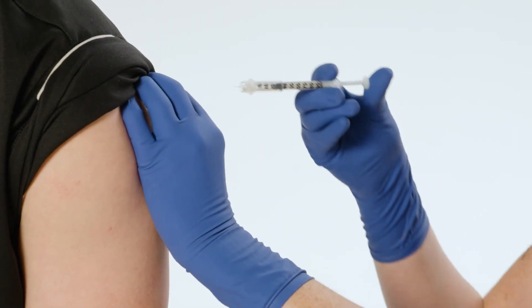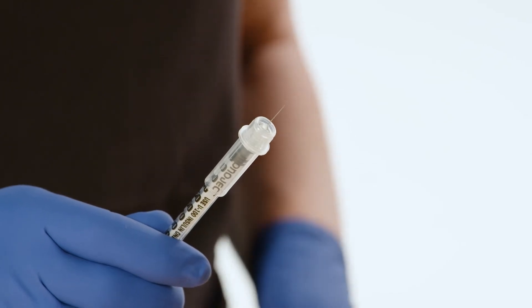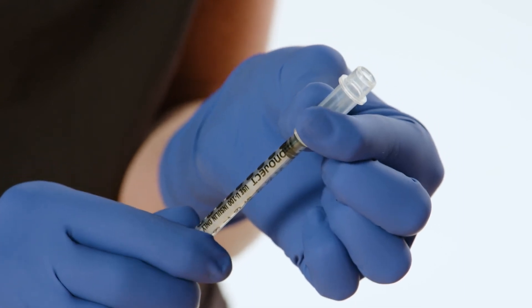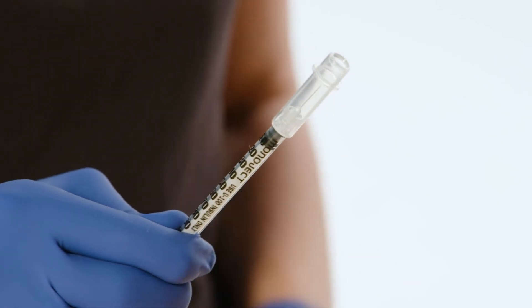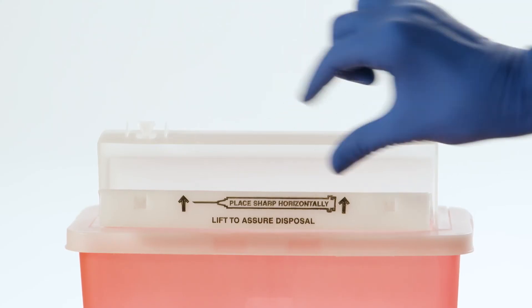Perform the injection following your facility's protocol. To permanently engage the safety shield, extend the shield completely forward into transport mode, then twist the shield in either direction until it clicks. This tactile and audible click indicates it is locked and ready for disposal in an approved sharps container.